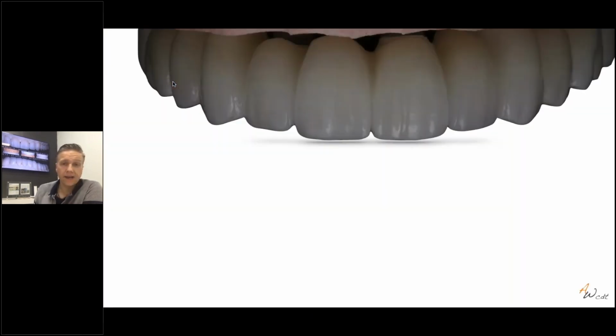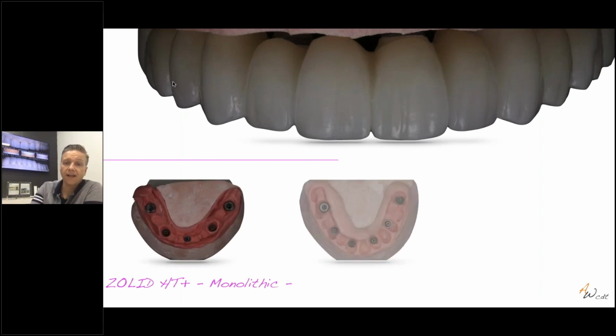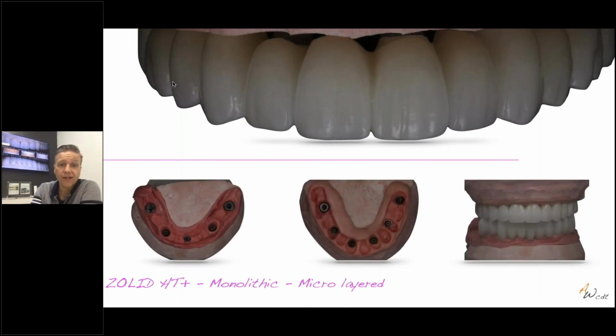Here, a typical case just to show how the HT Plus is versatile. That's basically not a hybrid, it's a crown and bridge case just with the screw-in crowns and pontics, yeah, so upper and lower in full contour, micro layered.